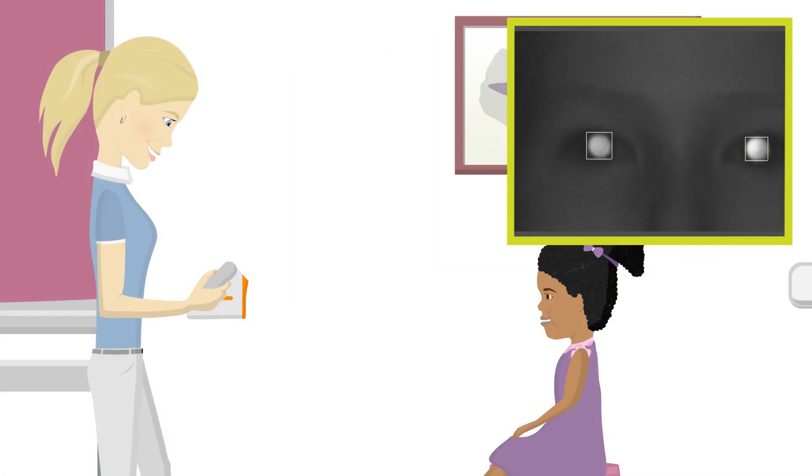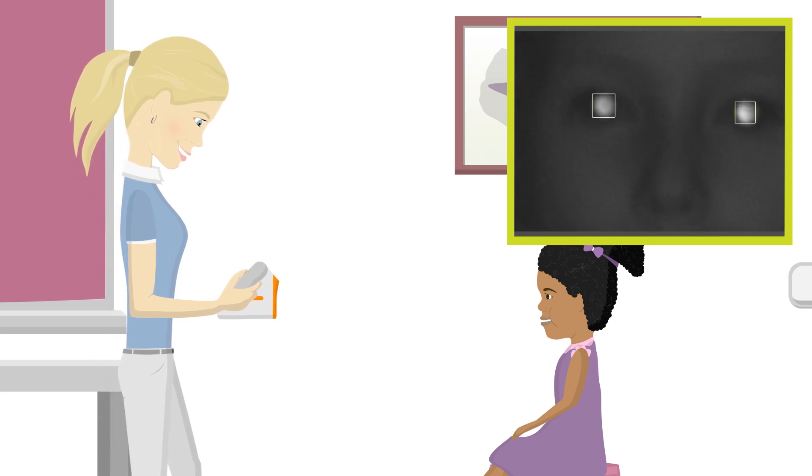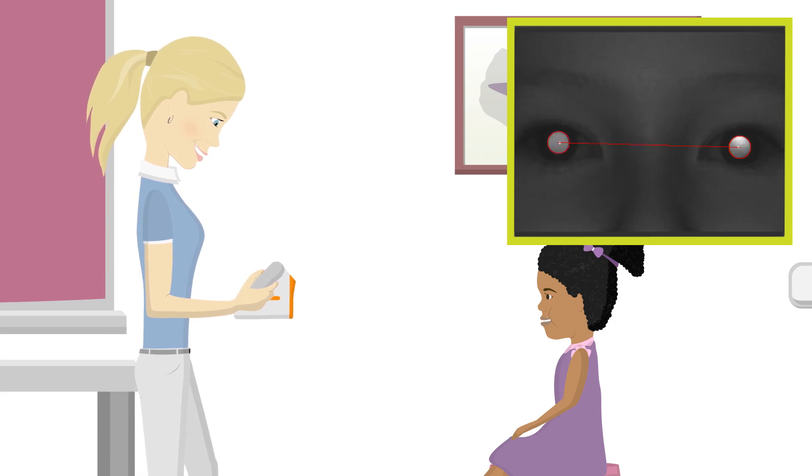Since Anna is standing too far from the child, she will see white squares around the pupils in a blurred picture. As Anna moves forward, the squares will turn to red circles and the picture is in clear focus.